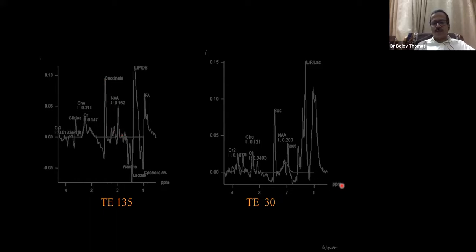So if you see the cytosolic amino acids, in this particular clinical situation you are most likely dealing with a pyogenic abscess. The pyogenic abscesses are full of neutrophils, and the neutrophil degradation products lyse the protein into amino acids, and you see a lot of them.